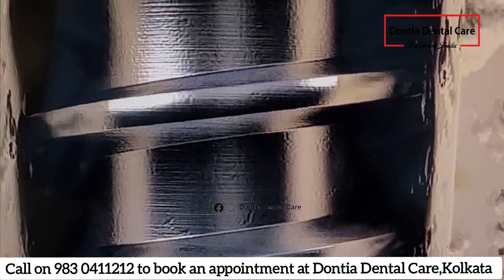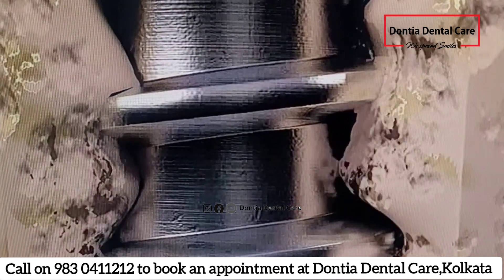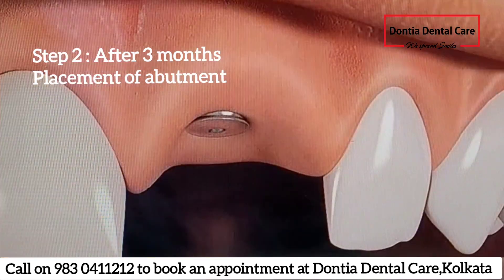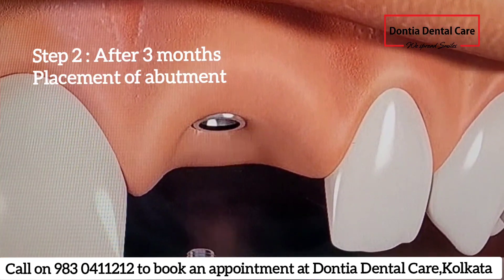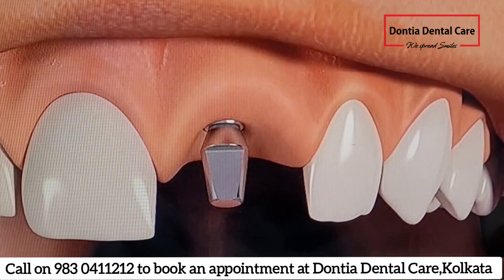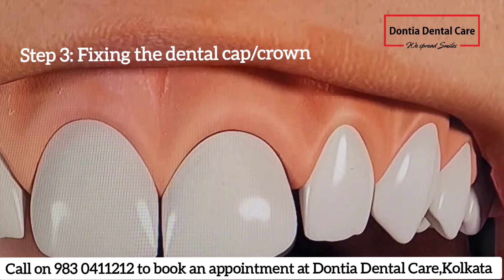It takes about 3 to 4 months for bone to grow and bind with implants, just like it is shown in the video. After complete healing and integration of bone with the implant, the cover screw is removed and an abutment is placed on the implant, over which a crown is fixed, as seen in the video.